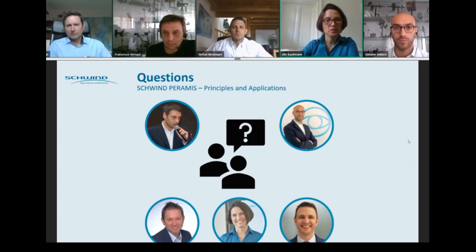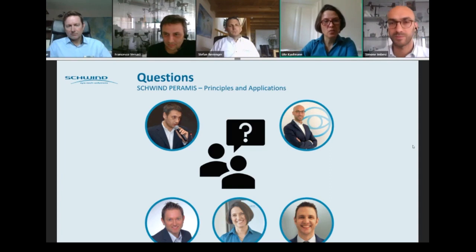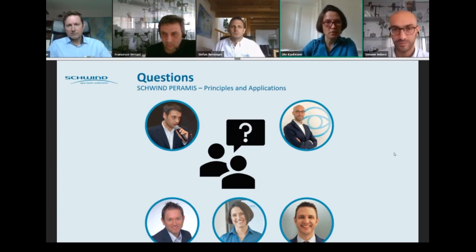Okay, great. And I think there is one question left, which also is a nice link between the presentation of Francesco and Simone, because one of the participants would like to know how to separate corneal higher order information from the aberrations, especially IOL aberrations.